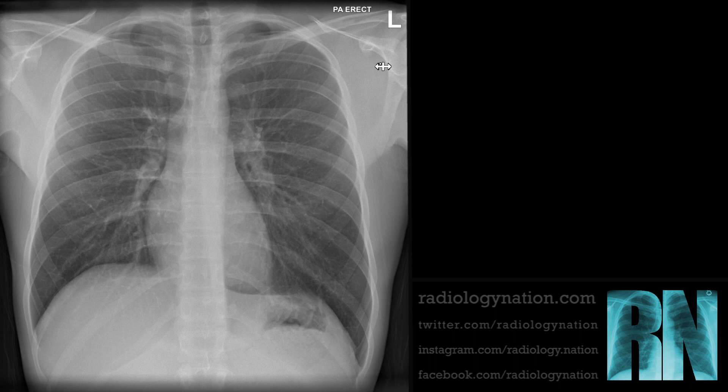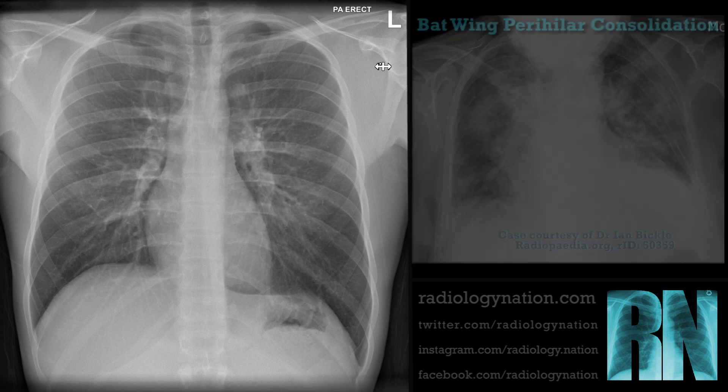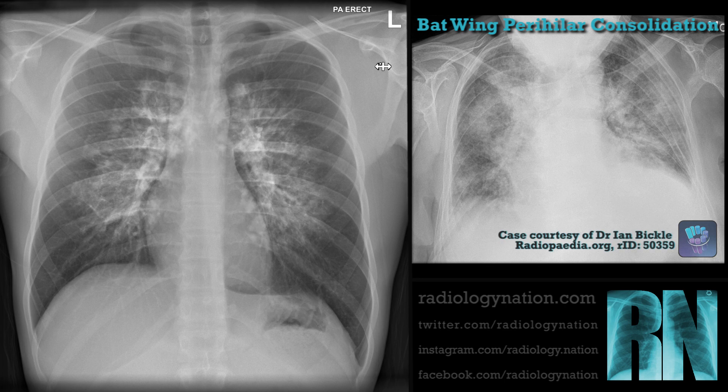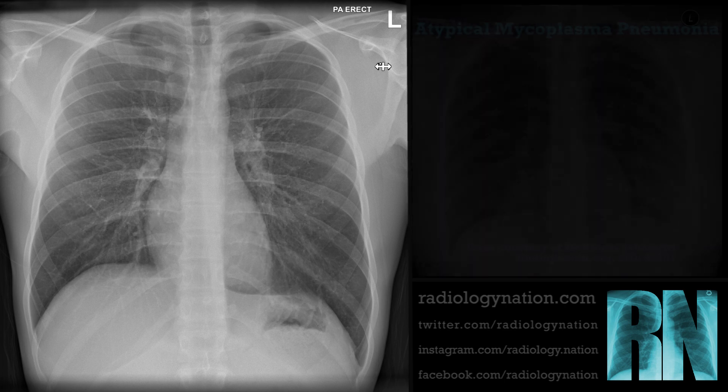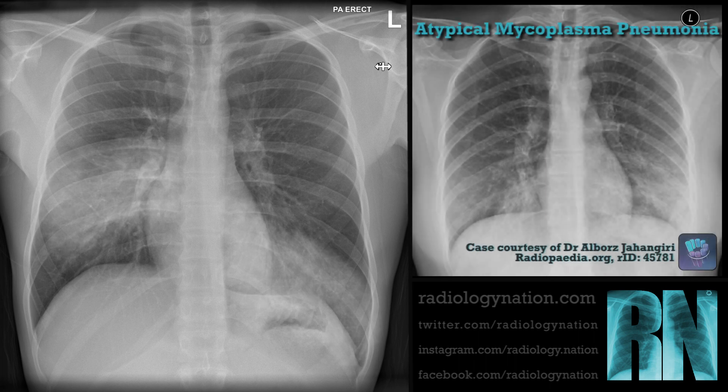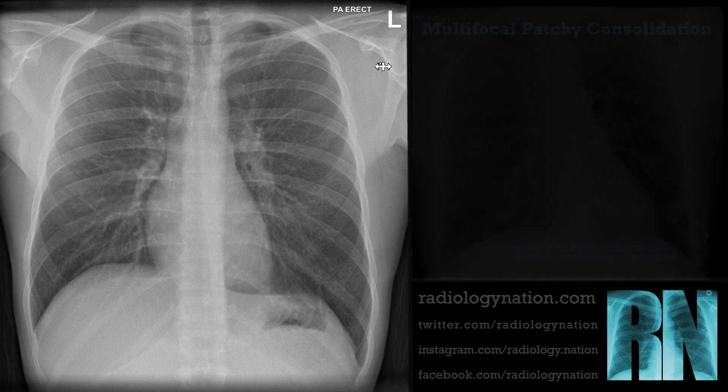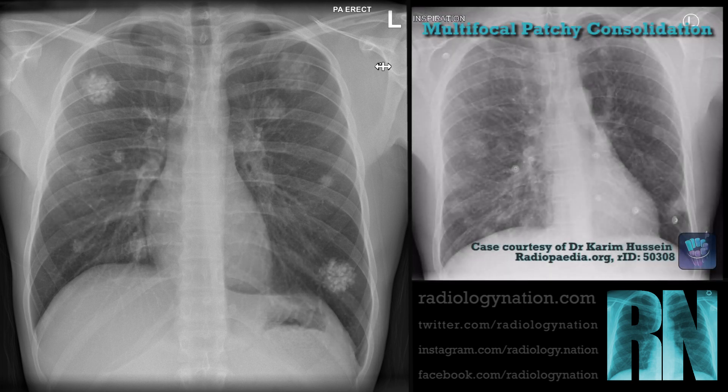In this video, we have shown examples of consolidation limited to a single lobe. However, bilateral batwing perihilar consolidation is often seen in pulmonary edema. Certain causes of pneumonia, such as atypical bacteria and viruses, can present with bilateral disease. Multifocal patches of consolidation are associated with septic emboli, autoimmune disease, and traumatic contusions.